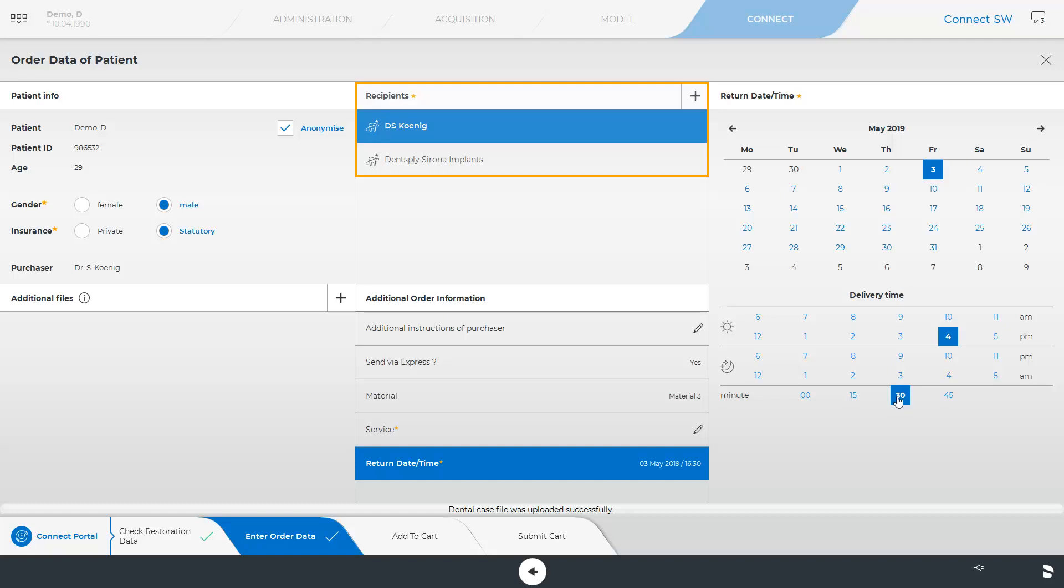We can choose between the dental labs named D.S. Koenig and Dentsply Sirona implants. For ordering Atlantis or MySimplant products, the option Dentsply Sirona implants should be selected.